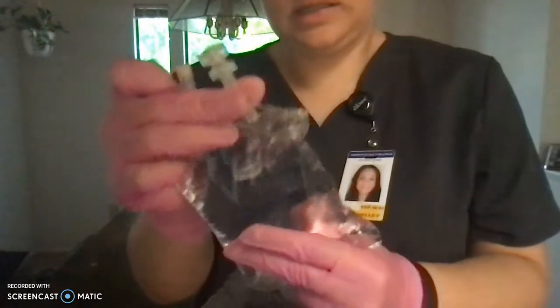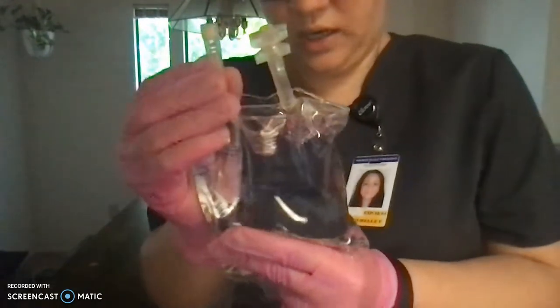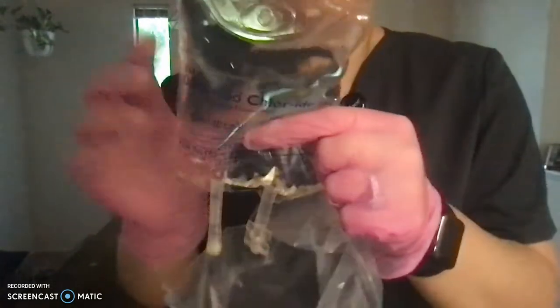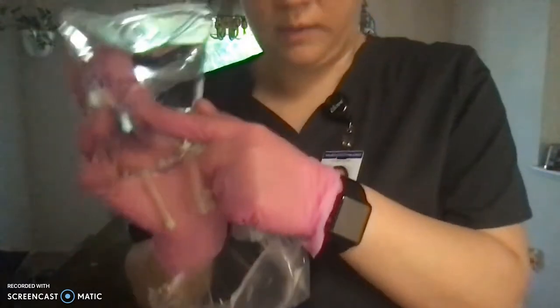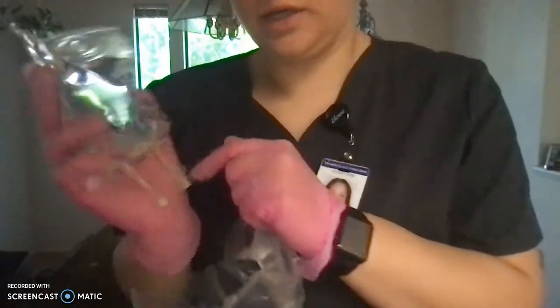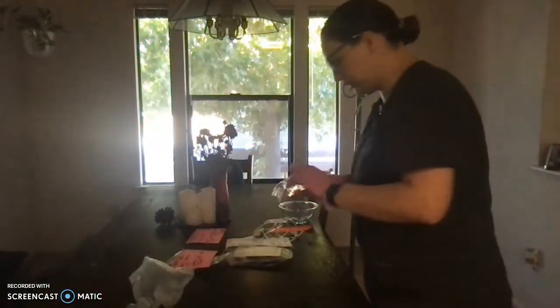Making sure that the sterile end is still intact. This is another medication port, and then we're inspecting the fluid inside, making sure that there's no floaties, it's clear, not cloudy, and that you have the right medication, right percentage, and the right mLs if you can, as much as possible.